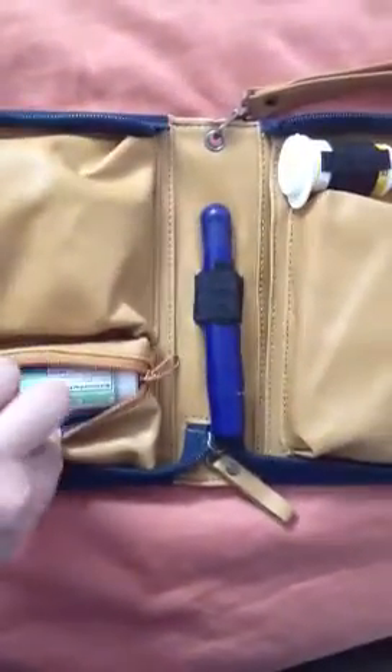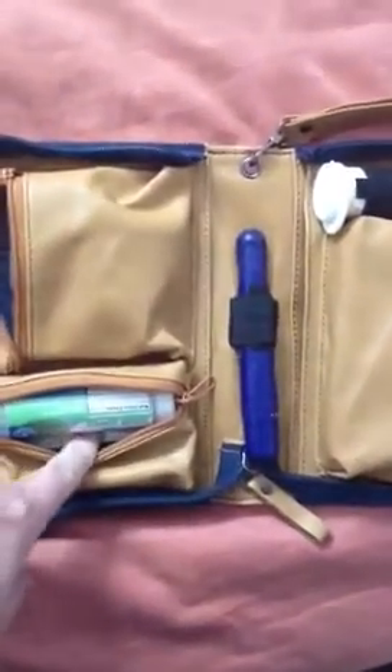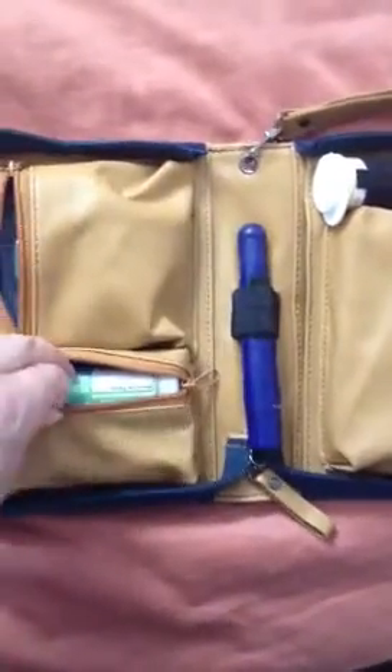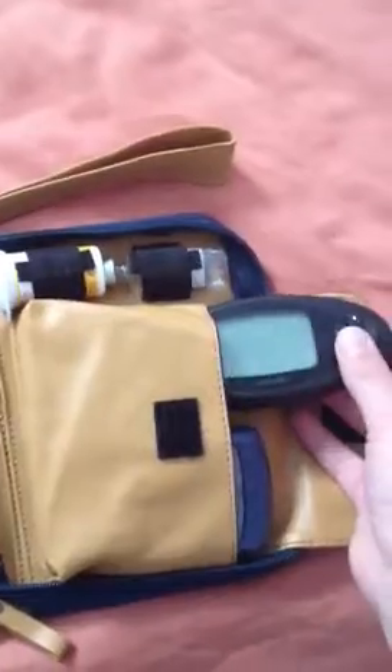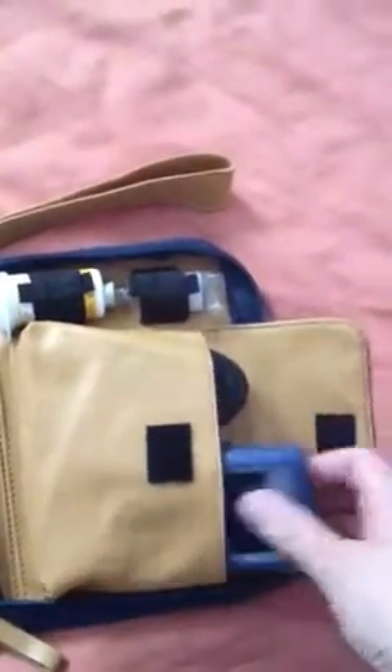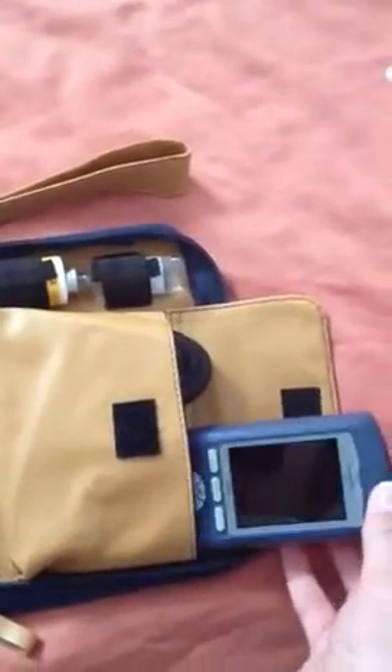In here I've got a syringe, some Splenda, and some glucose tabs. Here I've got my trusty AccuCheck Multiclicks. Here are my test strips, my insulin, and in this pocket I'm actually able to house both my continuous glucose monitor and my Omnipod PDM.